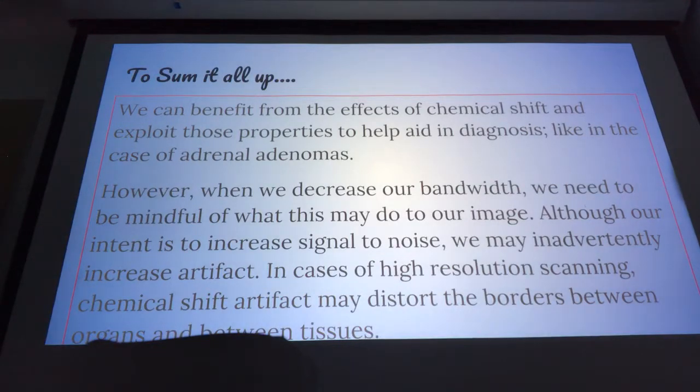And to sum it all up, we can benefit from the effects of chemical shift and exploit these properties to help aid in diagnoses, like in the case of adrenal adenomas.